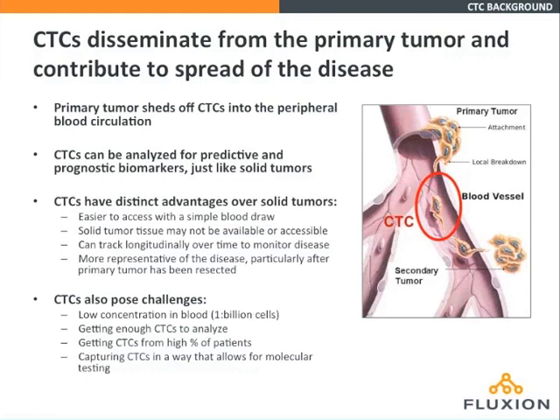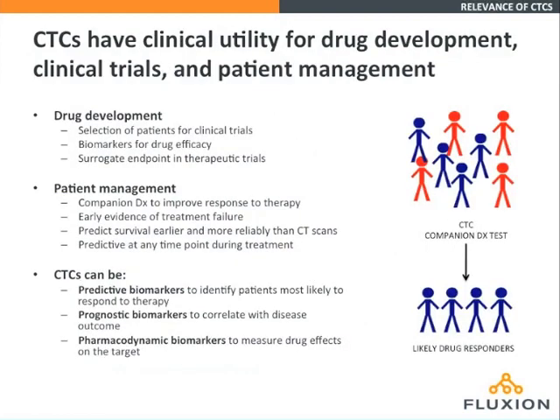The challenges that we've tried to address have been there for quite a while, and they are basically due to the fact that the concentration of these cells in the bloodstream is very low. The challenge then is to recover enough CTCs in order to provide meaningful analysis that clinicians or clinical researchers will believe. Therefore, what we've really focused on is improving this recovery efficiency, and in particular, the number of cells and genetic material that can be extracted off chip.